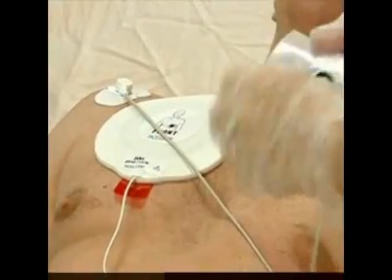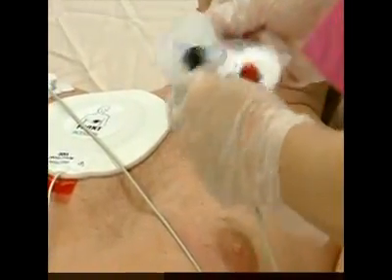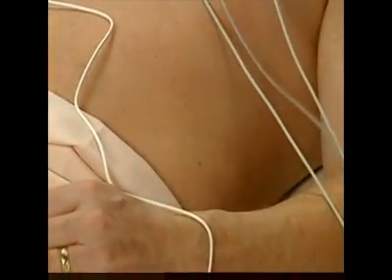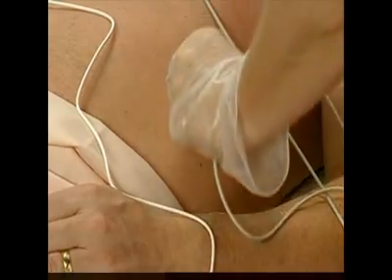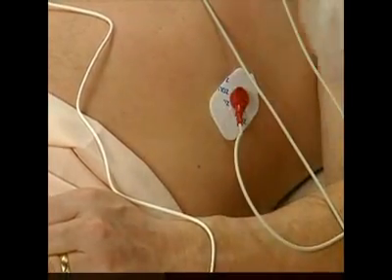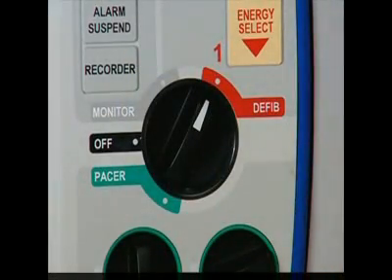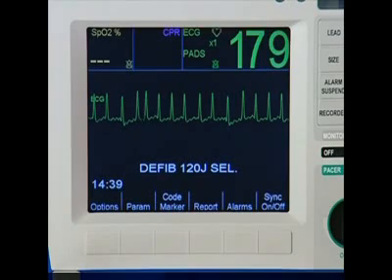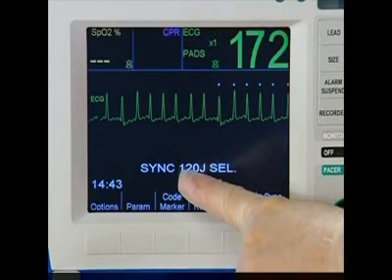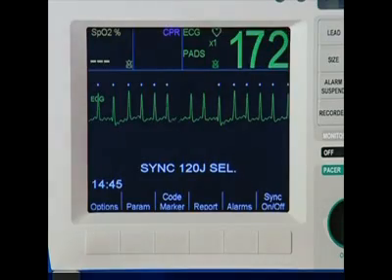Then apply the three ECG leads. To begin cardioversion, turn the mode selector to defib. Next, press the sync on/off soft key. Verify that you see the word sync before the joules setting.